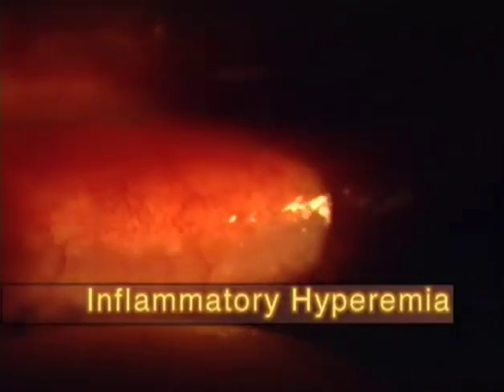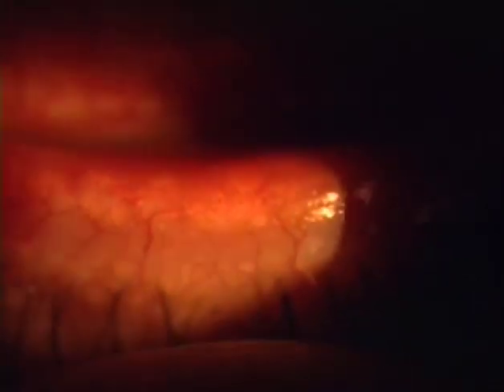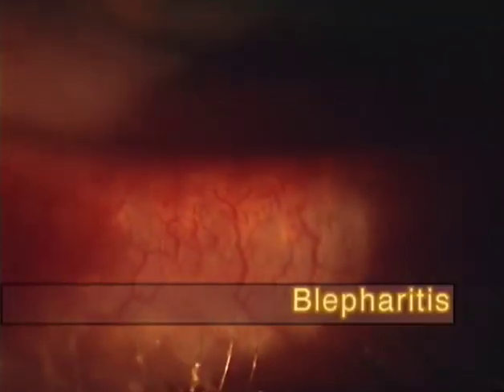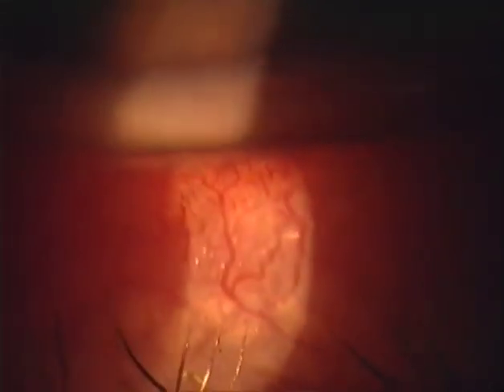In inflammatory hyperemia, both types of vessels may become dilated, so that the dilated cutaneous vessels merge with dilated conjunctival capillaries. In more severe cases of lid margin inflammation, we find a generalized transformation of the vessels, so that the distinct separation between the vascular networks of conjunctiva and skin at the border is abolished. Compare this with the normal case we saw before.